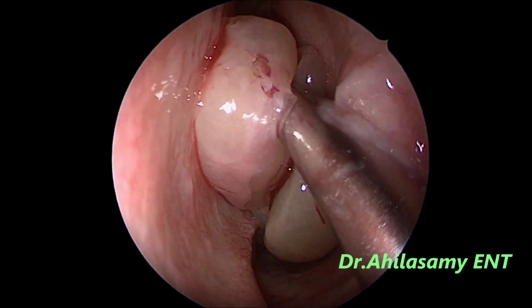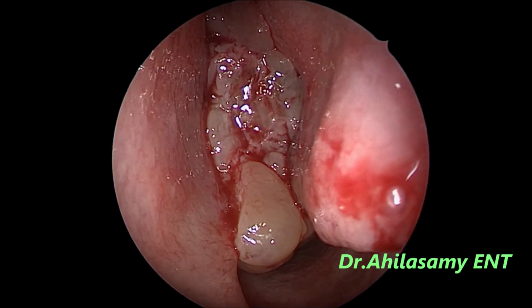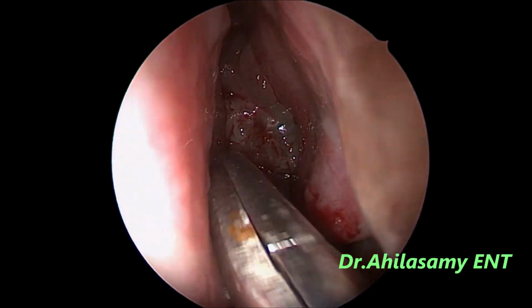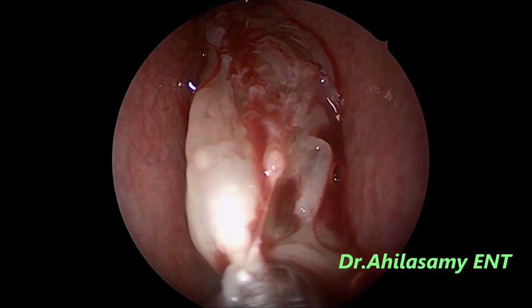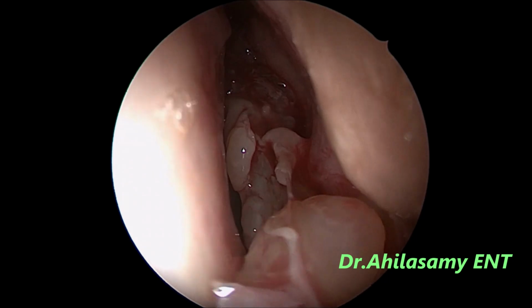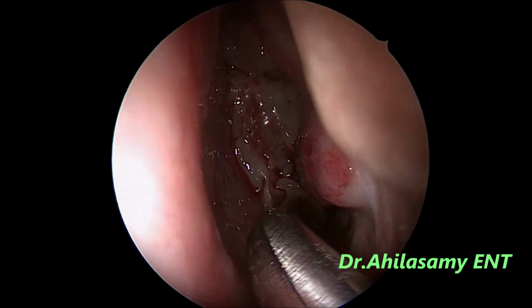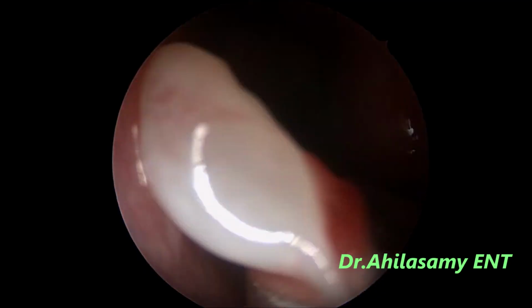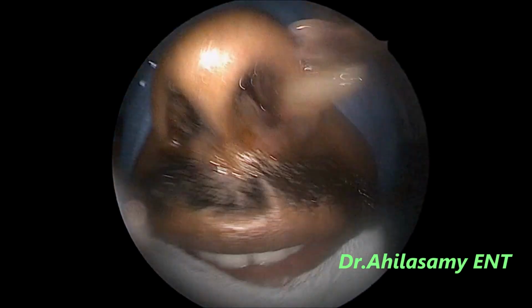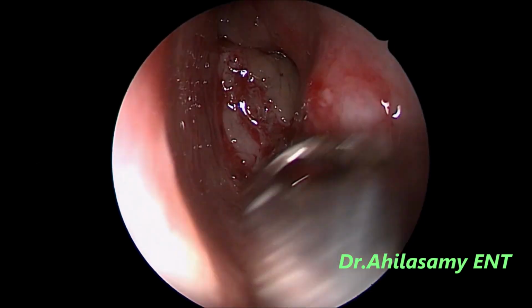It's not that you have to go for a costly shaver system. This Vansari Marketing has a very good shaver system, and if you use a Xomed blade, it works as well as the Medtronic shaver system. But the maintenance of the shaver system is very important.